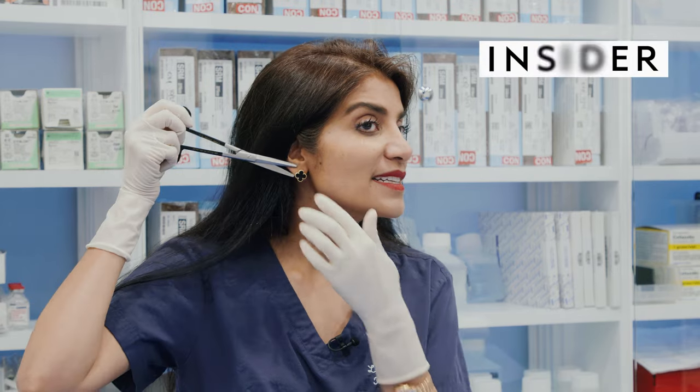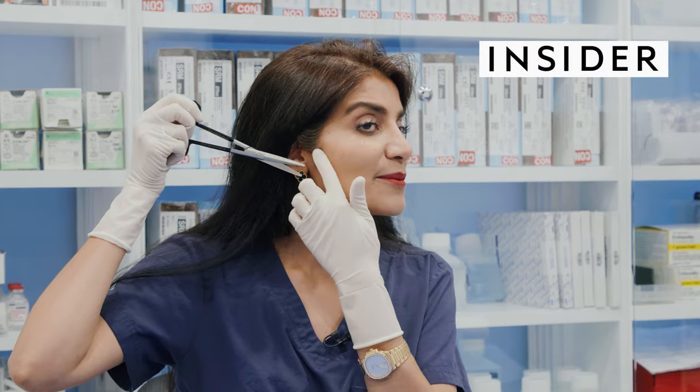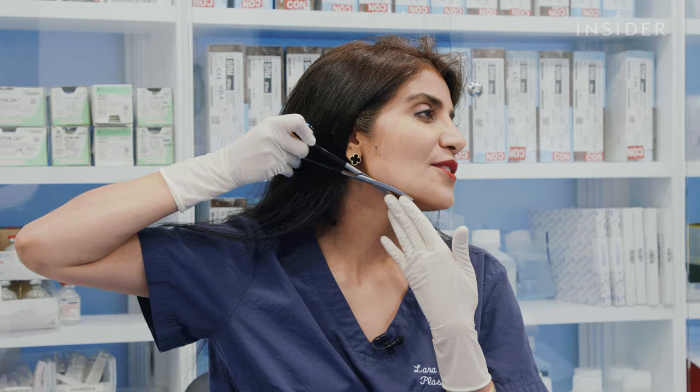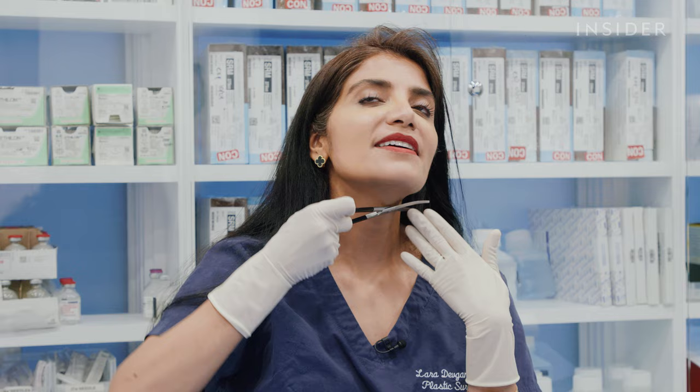So they're inserted right here, all the way into the face, from here all the way down here, through the neck, all the way over here. And you can really literally separate someone's face from the deep structures below it.